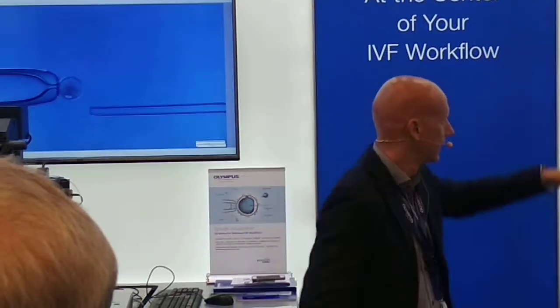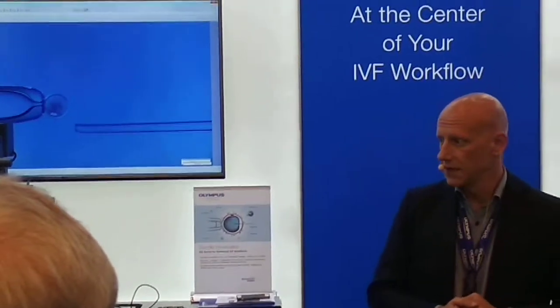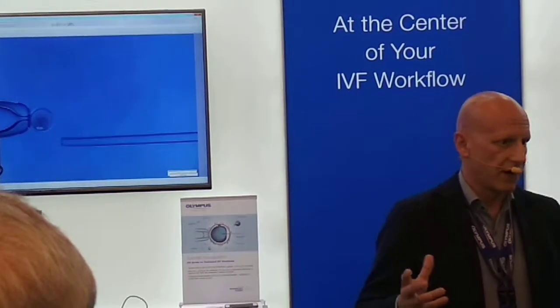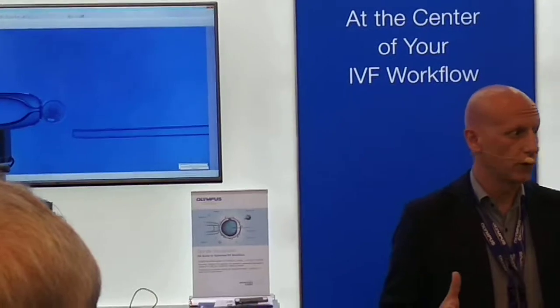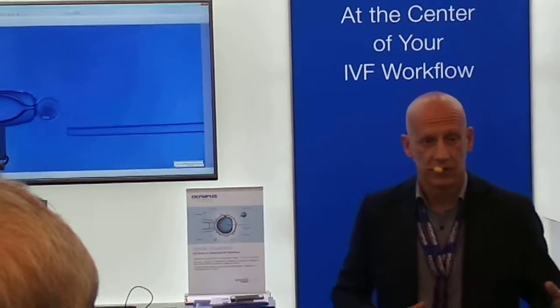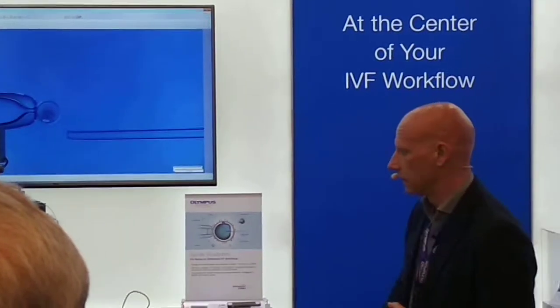Now here we have the two screens where you will be able to see the spindle. Polarization at the end is not a very complex technique, but it requires some adjustment of the microscope. So by automating these processes, we ensure that it's very, very easy for the embryologist to change from one observation method to the other.